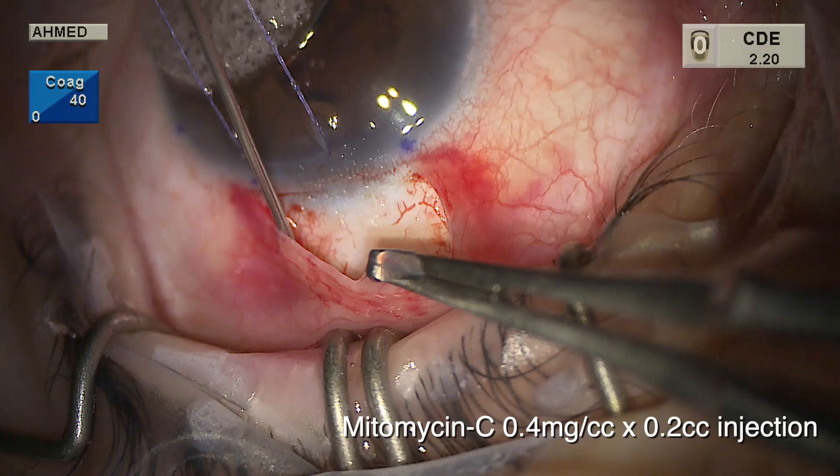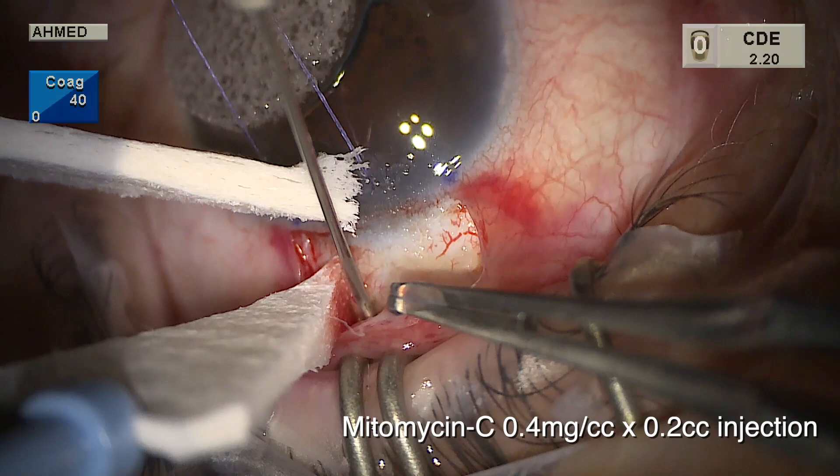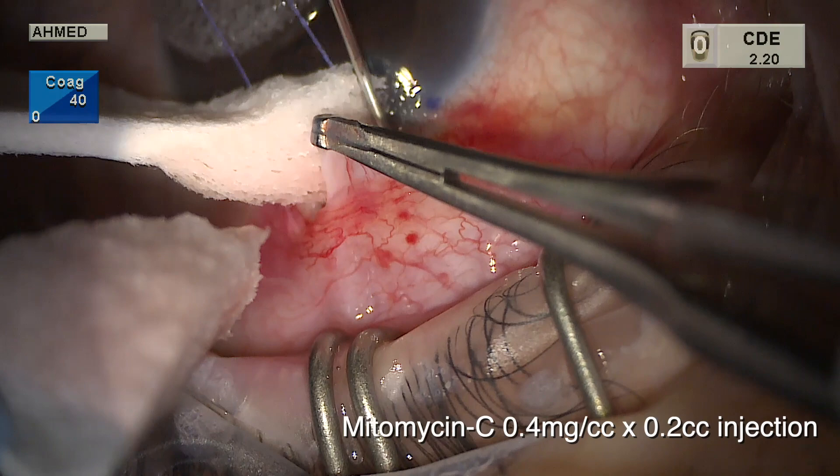Mitomycin is now being used — injected under Tenon's rather than via sponges, at 0.4 milligrams per cc, about 0.2 cc, keeping it posterior and away from the limbal area. This avoids avascularity at the limbus, placing the mitomycin where it needs to be — posteriorly, approaching about two millimeters from the limbus but no further anterior.